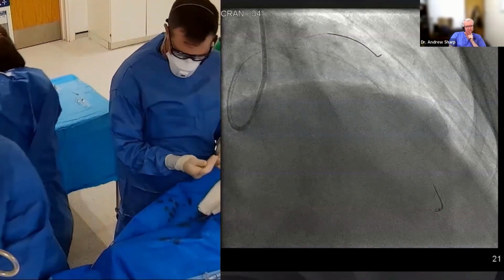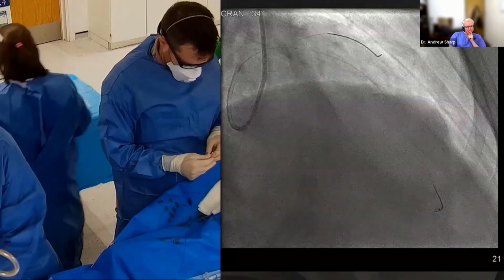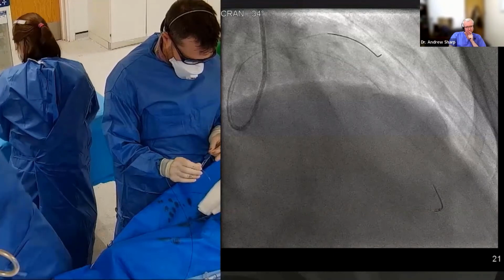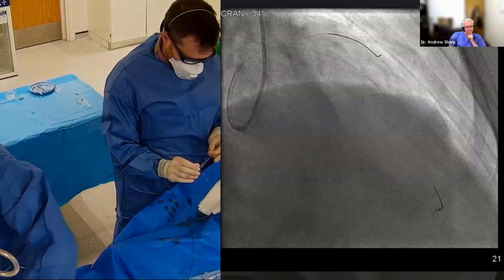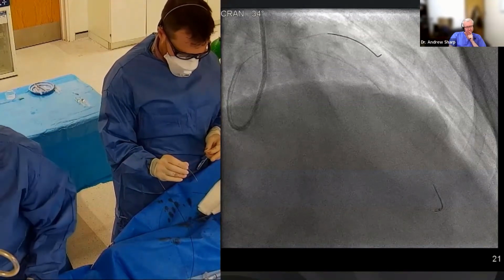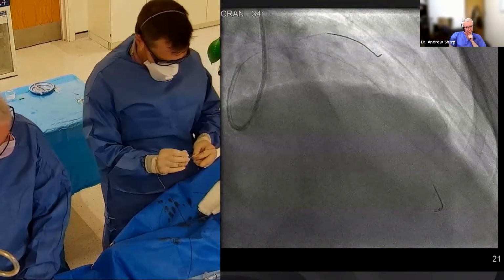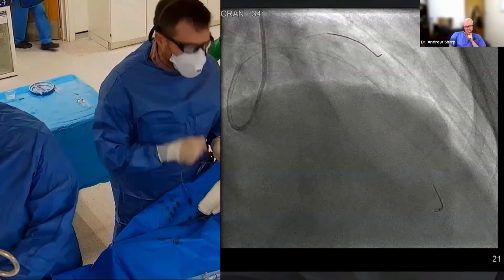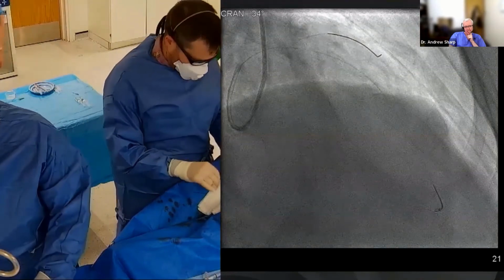So I always just give it another little injection. Just tap, make sure your bubbles are at the top. Whoops, that was unexpected. Okay, we're going to have to refill that if you don't mind. You got some coming out there? Yeah, that's great. Thank you. Cheers.